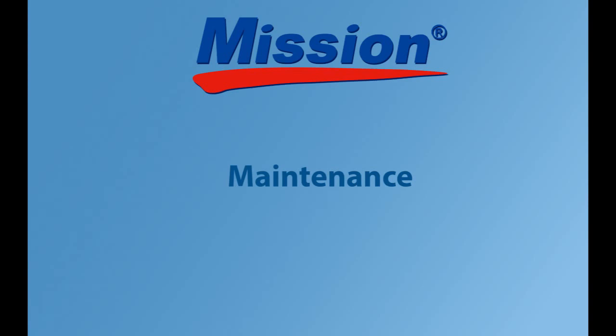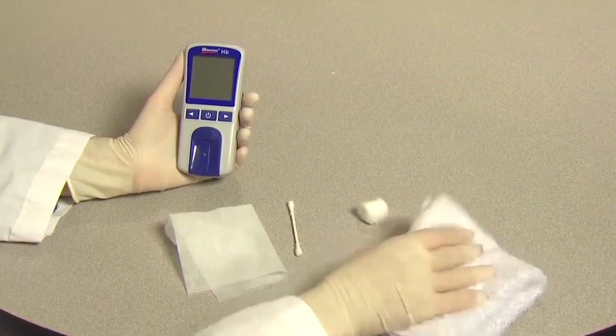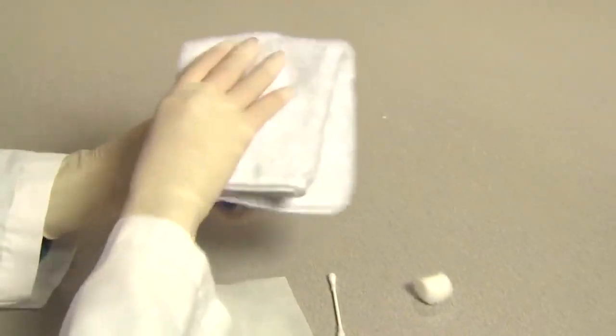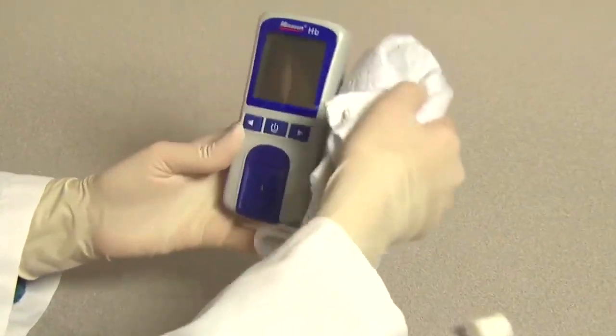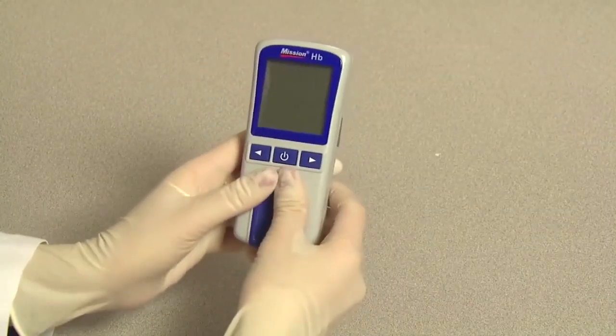Maintenance. For best results, the meter should be cleaned after each day of testing. Clean the meter surface with a dry or a damp cotton cloth. Use a dry soft cloth to clean the LCD.